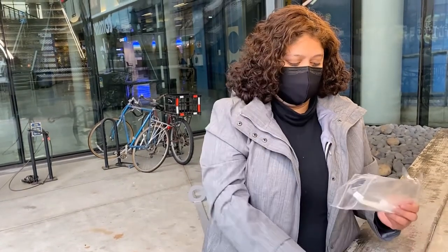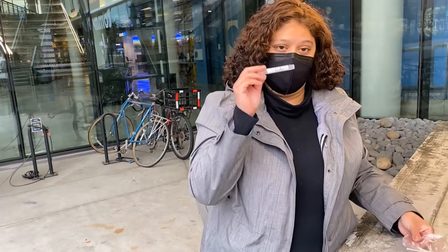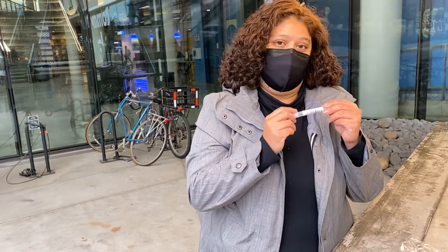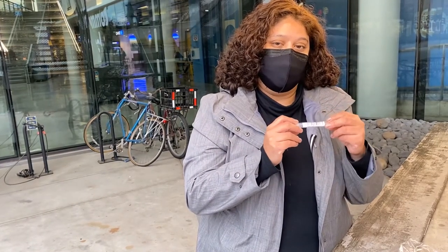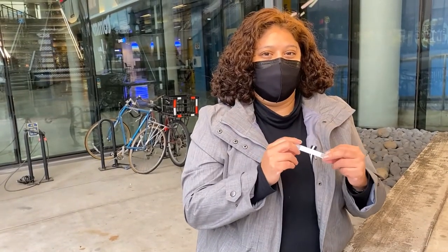You'll want to keep the bag so you can safely transport your test to the drop box. The test kit will come with instructions, a swab, and a tube. The first step is to scan the barcode on the tube using your UCSD app, and make sure the last four numbers match up to what comes up on your UCSD app.